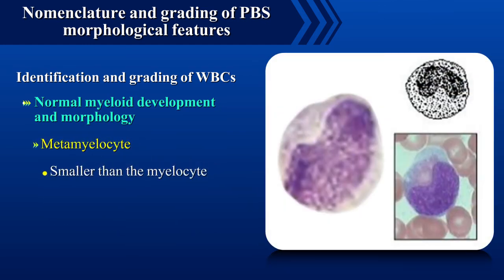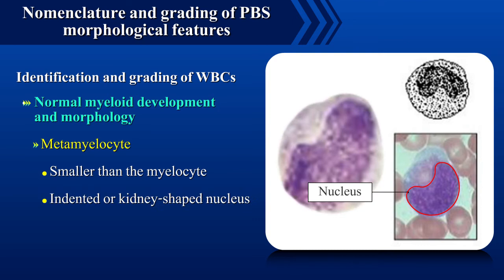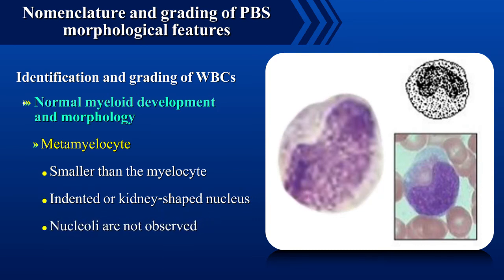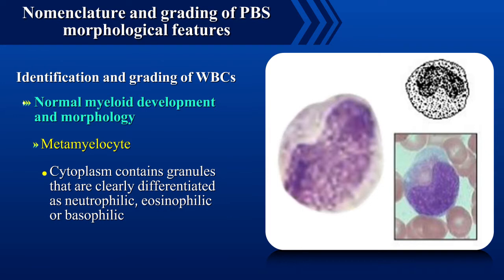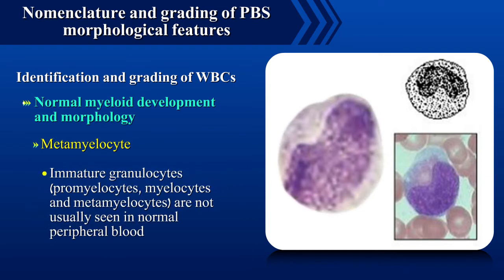Metamyelocyte is smaller than the myelocyte with an indented or kidney shaped nucleus. Nucleoli are not observed. The cytoplasm is usually clearly pink and contains granules that are clearly differentiated as neutrophilic, eosinophilic or basophilic. Immature granulocytes — that is promyelocytes, myelocytes and metamyelocytes — are not usually seen in normal peripheral blood.